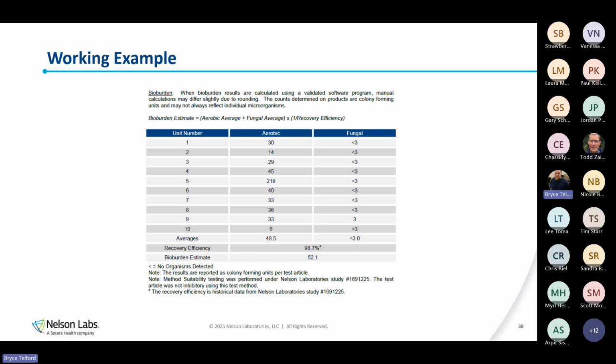They're in what we call log 100. And microbiologically speaking, for something such as EO, they're pretty much all the same, because whether it's 150 or 250, at the scales I'm working with EO, it really doesn't matter that much. It's all the same log.